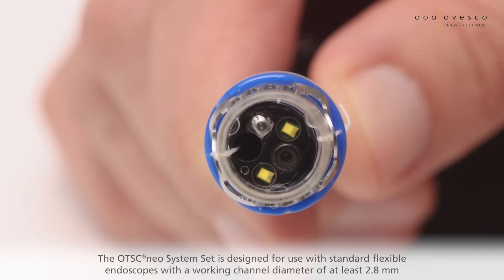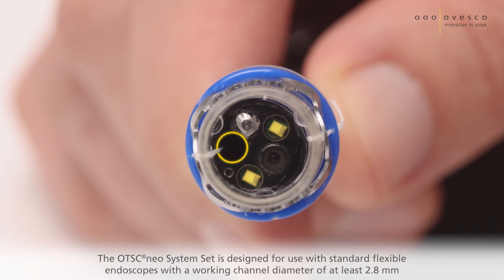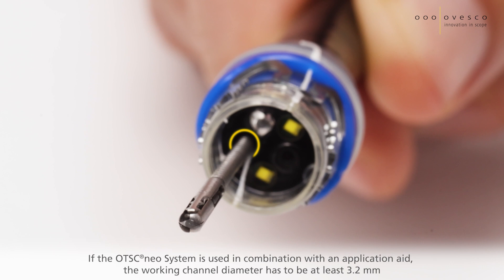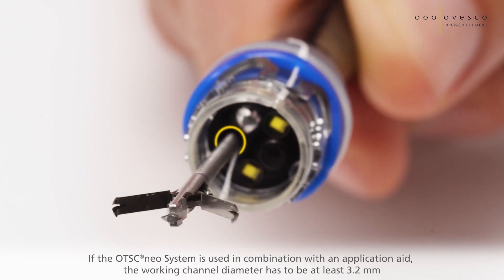The system is designed for use with standard flexible endoscopes with a working channel diameter of at least 2.8 mm. If it is used in combination with an application aid, the working channel diameter has to be at least 3.2 mm.